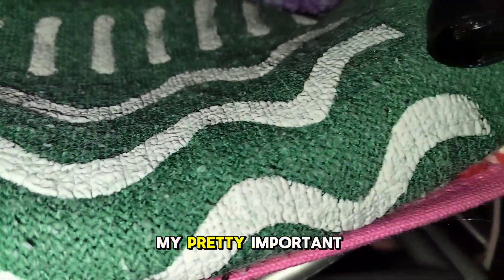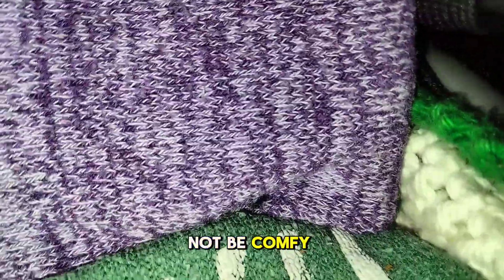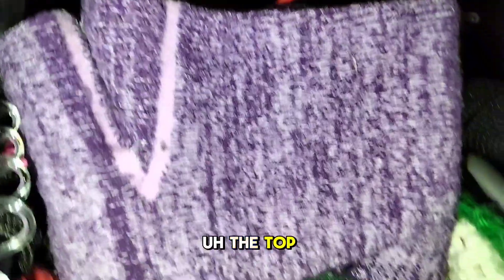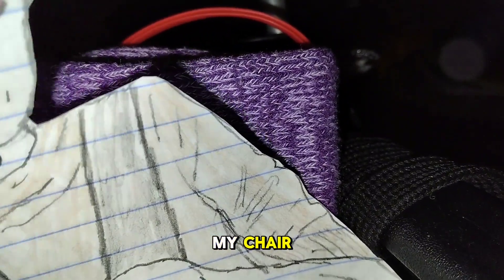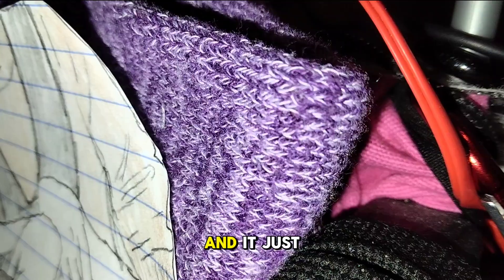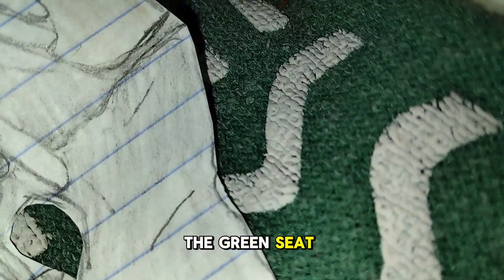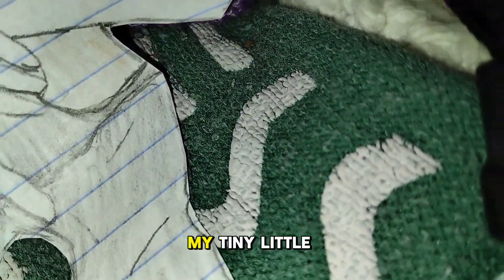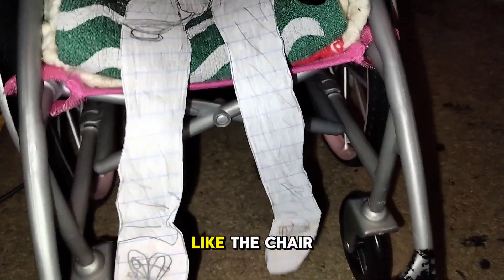Next up are my pretty important mats. Because obviously my chair would just be super low and it would not be comfy without these mats. The top one is a purple one which helps with back support when I'm moving in my chair — it keeps my back and shoulder comfy. The green seat helps with my legs and my tiny little atrophied butt. So it really does help, and I also get to move my little legs, not actually when they spaz. It's a very comfy add-on and I really like the chair.